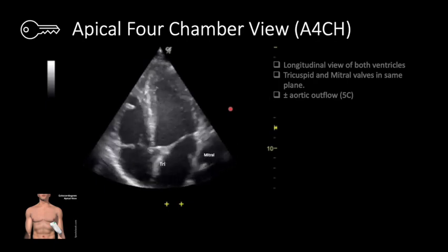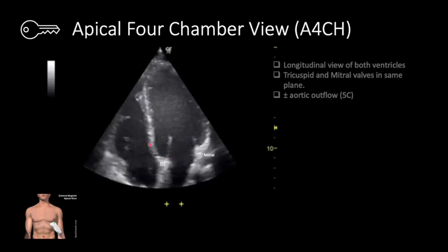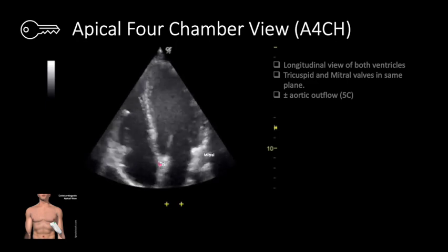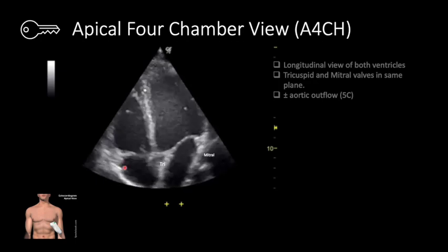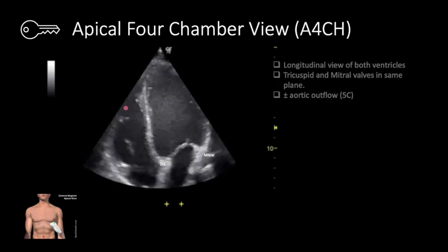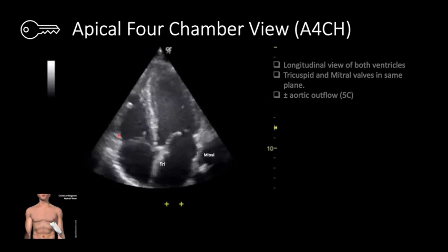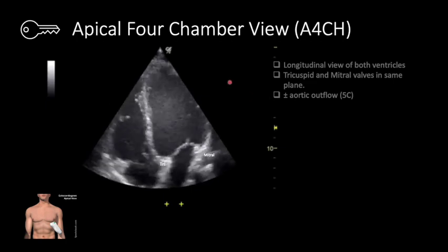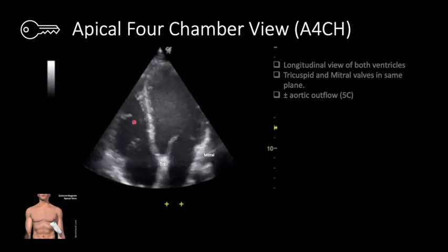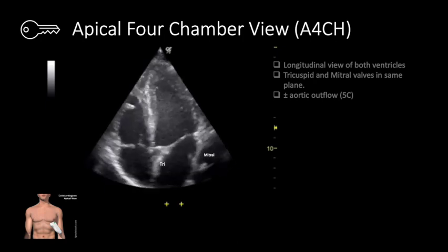We also see an example of how the tricuspid annulus down here, this bright shiny band of the tricuspid valve, the label's a little bit off there, should move during systole because this ventricle is contracting by shortening more than it is moving into the center, contracting radially. We can also see the moderator band up here in the right ventricular apex, all signs of normal anatomy.